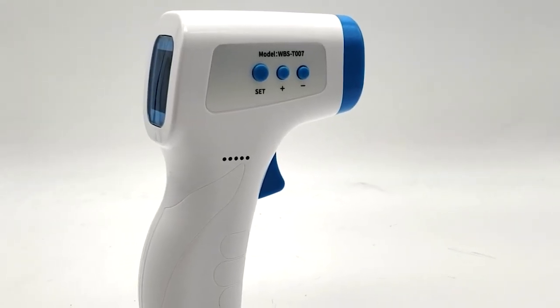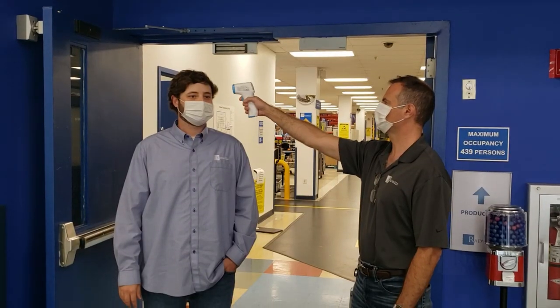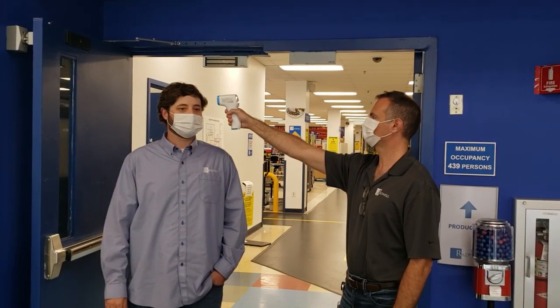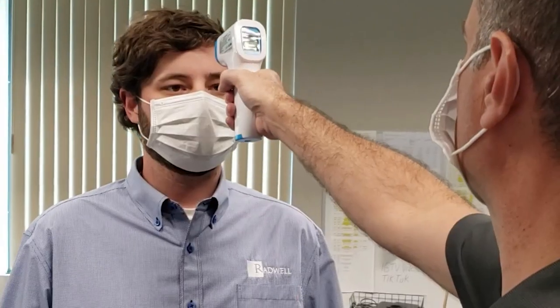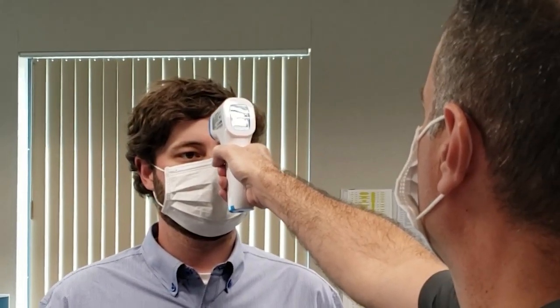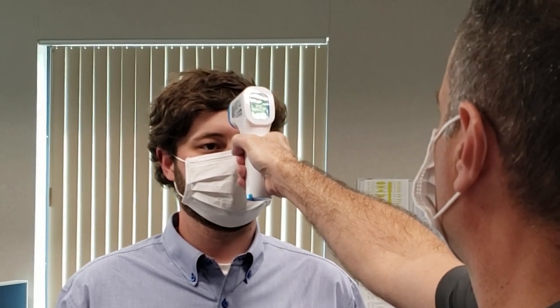There are some important recommendations to be aware of when operating this thermometer. The thermometer should be used in a stable environment and not in a doorway or in any setting where there are frequent temperature changes. The device should be pointed at the forehead without the participant sweating or having hair over the forehead. Eyewear should be removed because it may have an adverse effect on the readings.